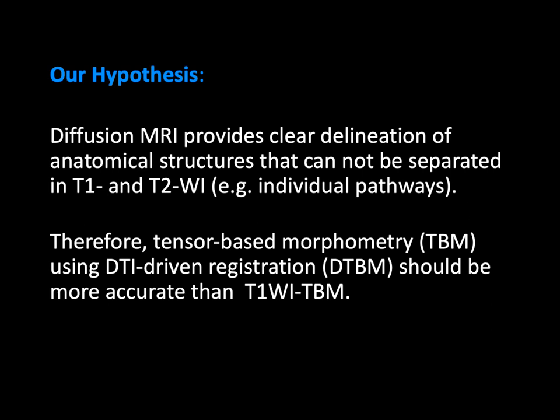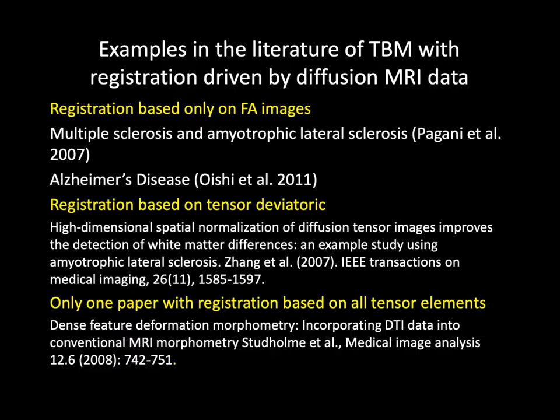So we say that since diffusion MRI contains this additional information, we may actually look at registration that is driven by diffusion MRI information, and that could be a more accurate and more informative registration. So this was our hypothesis a few years ago.